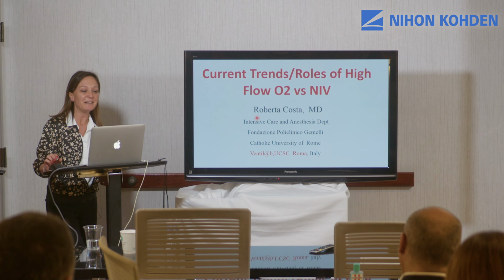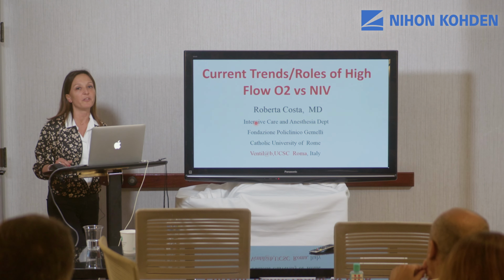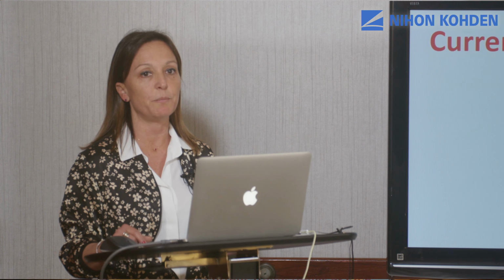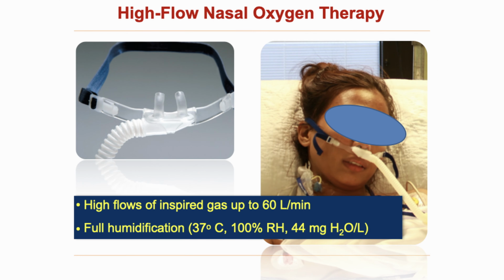So good morning, and I will try to give you an overview on the actual rules of high-flow nasal cannula versus standard oxygen therapy and versus NIV. First of all, high-flow nasal cannula is an oxygen therapy, but compared to the traditional oxygen therapy administered through the Venturi mask, high-flow nasal cannula allows us to administer really high flow to our patients, up to 60 liters per minute.